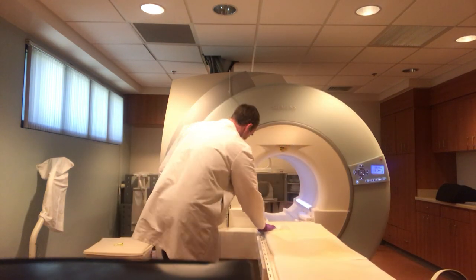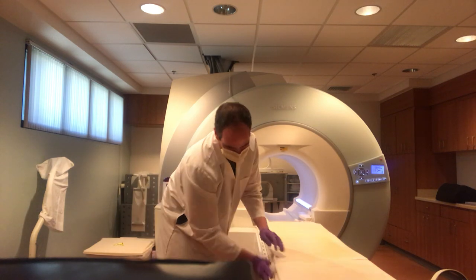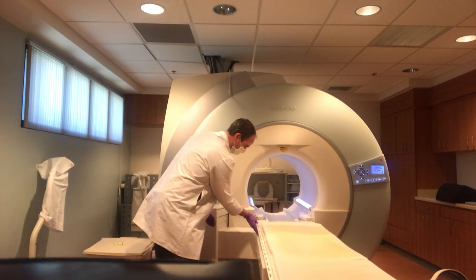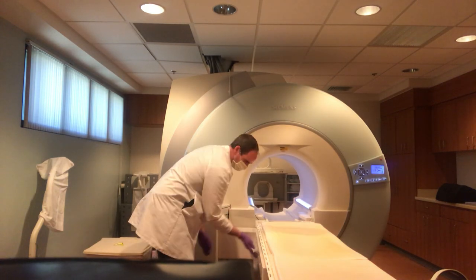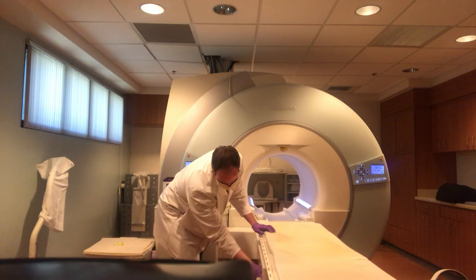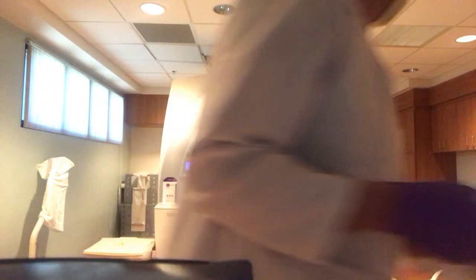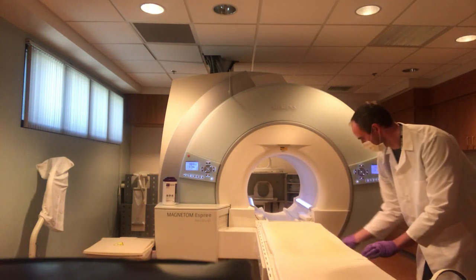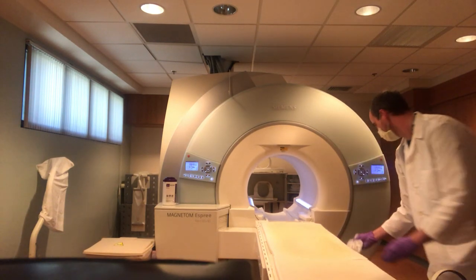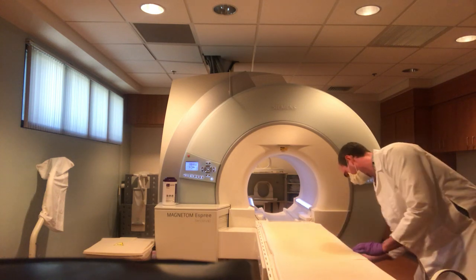The reason that we want to start with the bore and then the table and the pads is so that it has time to truly disinfect and dry before we set up for that next patient. We want to make sure that we get all surfaces that the patient potentially could have come in contact with.